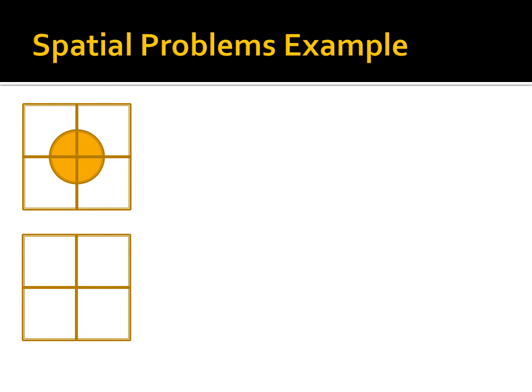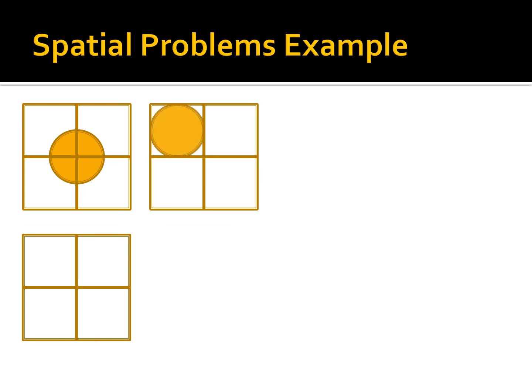If it were a linear object, 1 pixel in width, it would also be ignored because it would cover 50% of the pixel with 25% of the radiation penetrating the object. This dot represents the only situation where a 1 pixel dot gets recorded. In this example, the dot aligns exactly with the pixel.